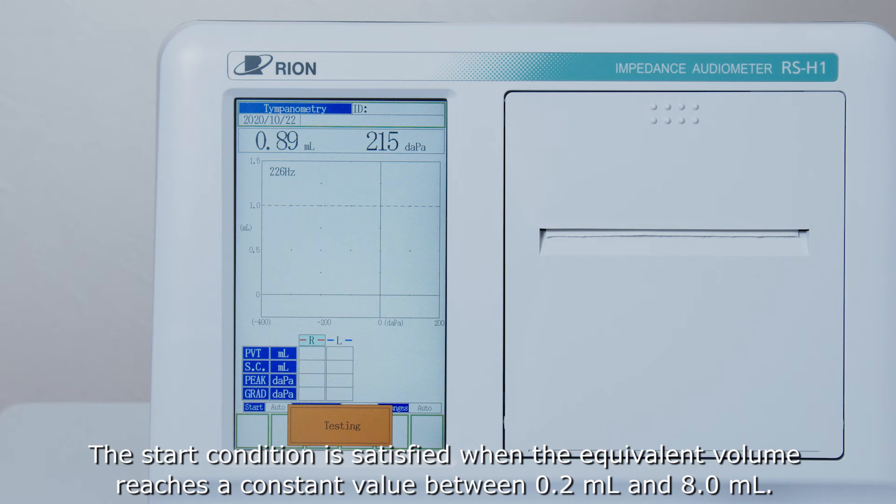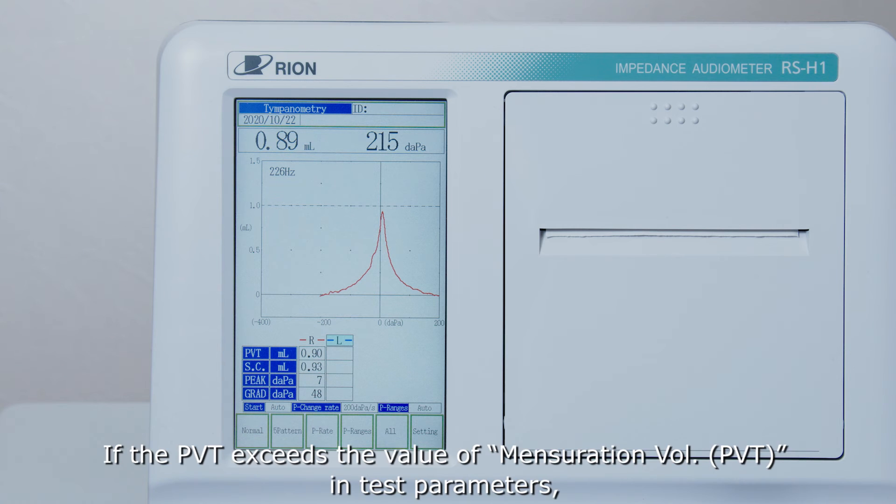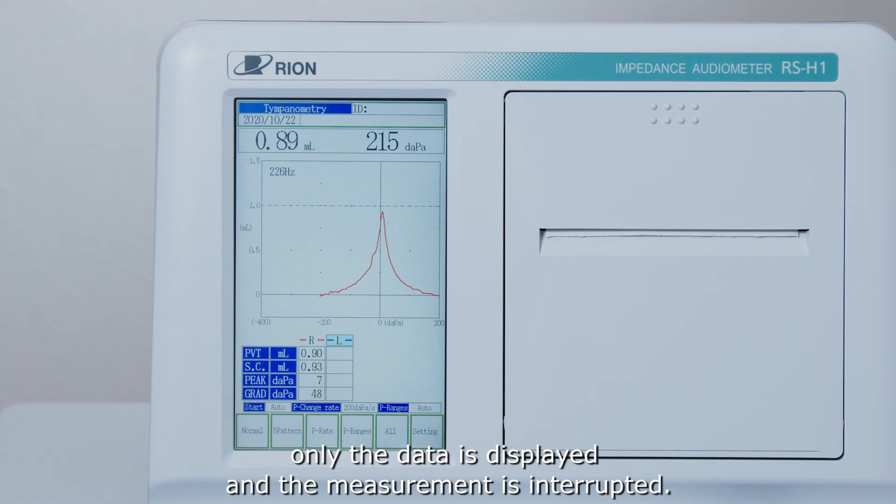The start condition is satisfied when the equivalent volume reaches a constant value between 0.2 millilitres and 8 millilitres. If the PVT exceeds the value of mensuration volume in the test parameters, only the data is displayed and the measurement is interrupted.